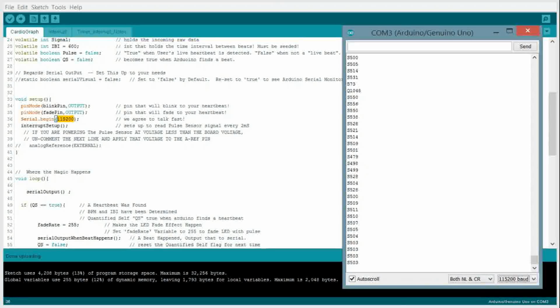All right, I'm going to turn auto scroll off just to give you a little idea of what's going on here. Basically, it's sending the signal data, S, and that's just what the pulse sensor is sending to the Arduino, and what the Arduino is reading. 500 is sort of the baseline. You've got a value between 0 and 1024, so 512 would be the middle. So it's going to be hovering right around there as a baseline. The B is the beats per minute, 76 beats per minute, and that's being calculated by the module and sent to the Arduino.